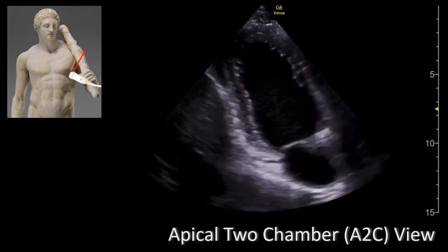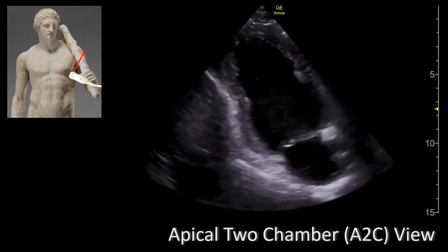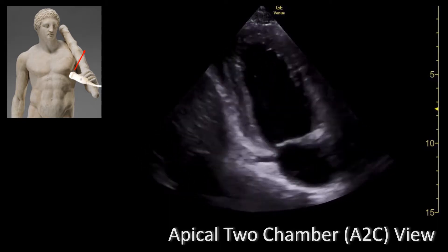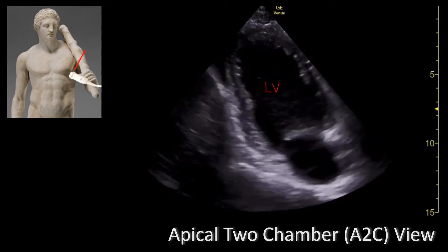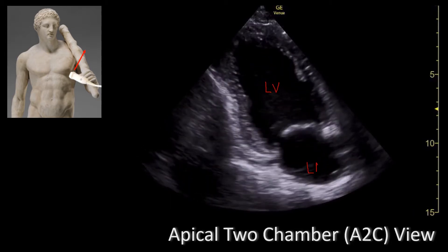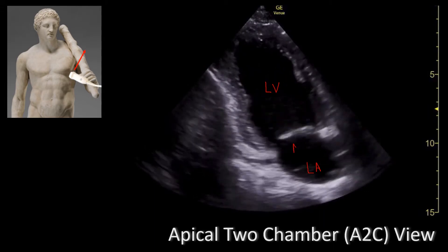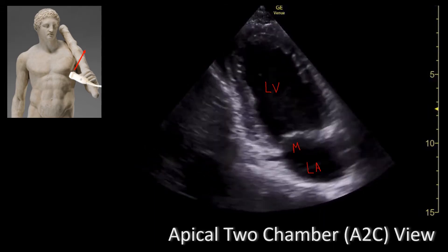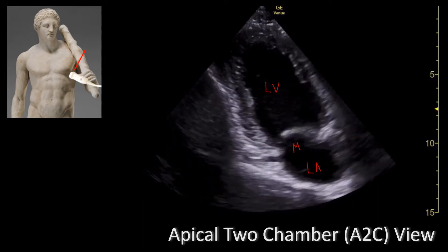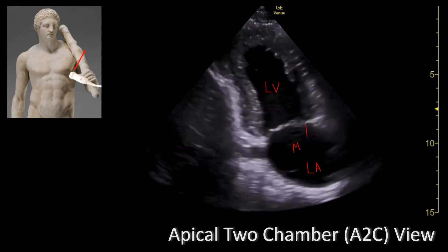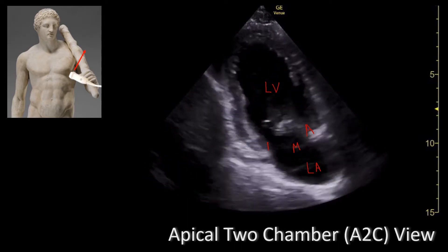Let's talk about the structures that we're looking at. Note that the apical two chamber view only focuses on the left side of the heart. Over here you have the left ventricle, and on the opposite side you have the left atrium. In between those structures you have the mitral valve, which has two leaflets: the anterior leaflet and the posterior leaflet. The anterior is going to be a larger leaflet and the posterior is going to be much smaller.